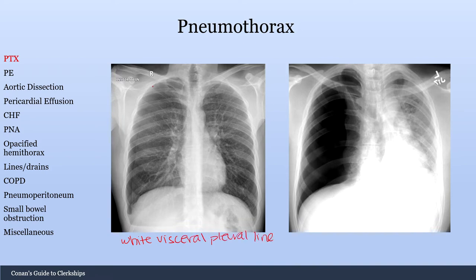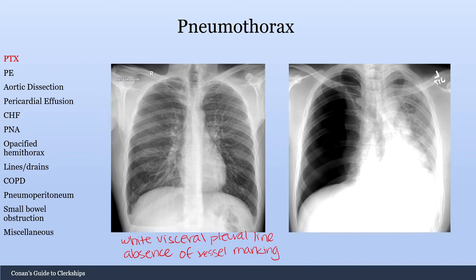Another finding is the absence of vessel markings past this visceral pleural line, which is another finding of pneumothorax. Here you can see all the vessel markings, and you don't see that out in the periphery.